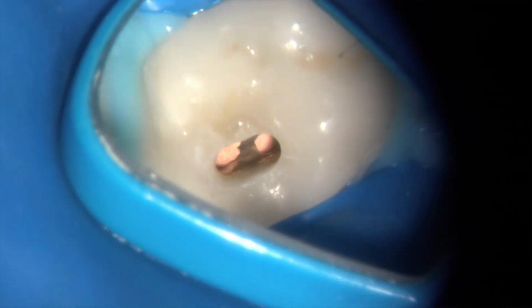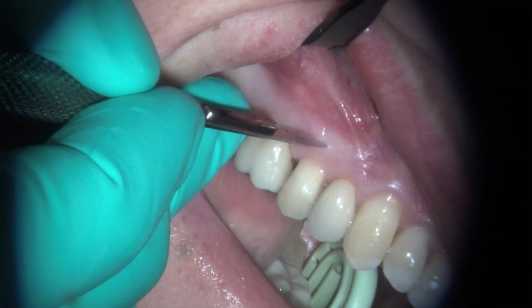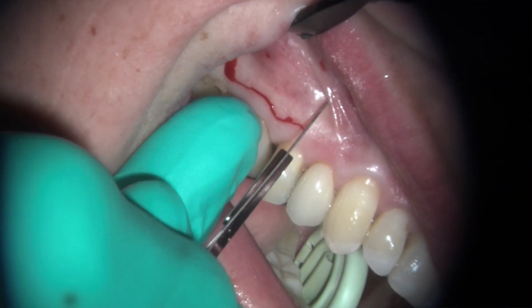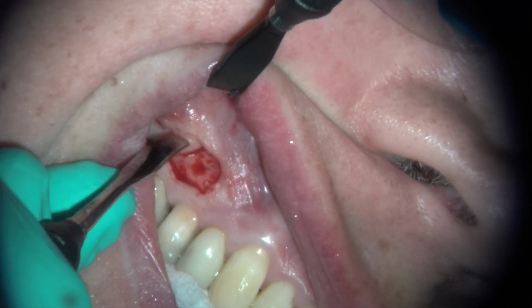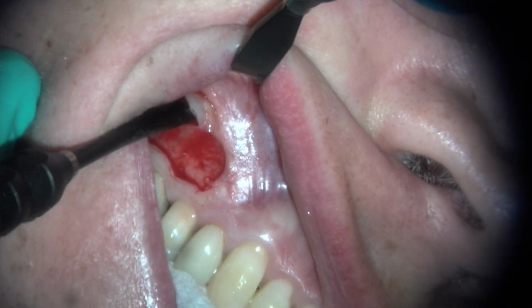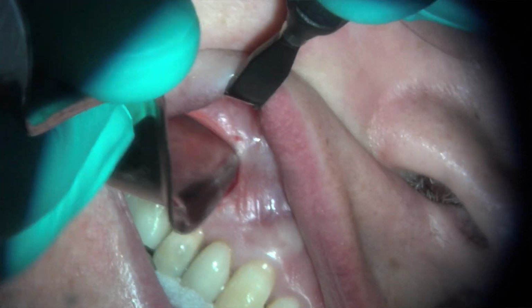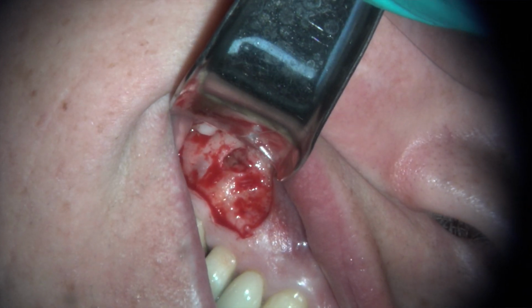Now, at this point, we place BC liner, and I use the blue BC liner, as I've mentioned before, in the access preparation. And now very quickly in the same visit, we proceed to do a quick incision, and I'm doing a submarginal triangular incision here. And we go in there and quickly reflect a flap in order to be able to enucleate, remove and curette the large lesion that was at the apex.